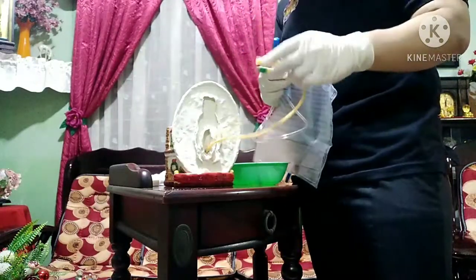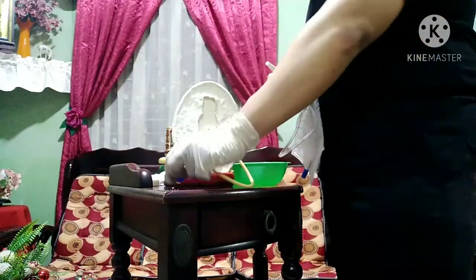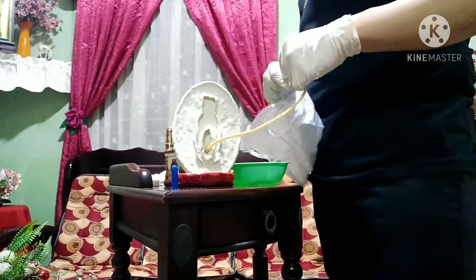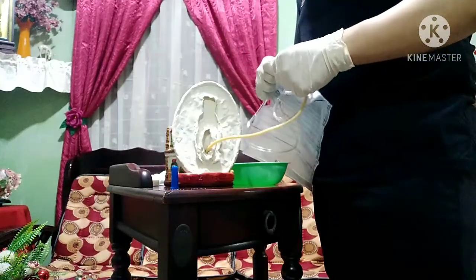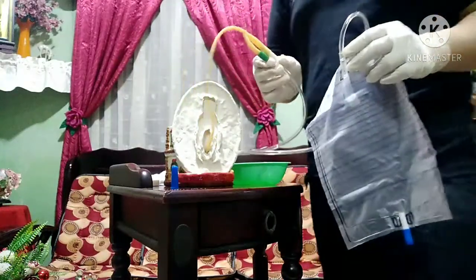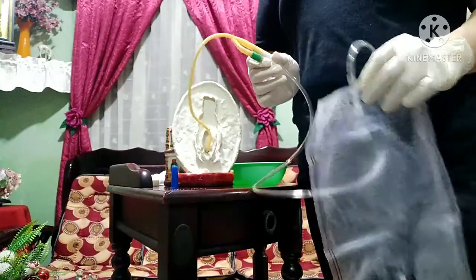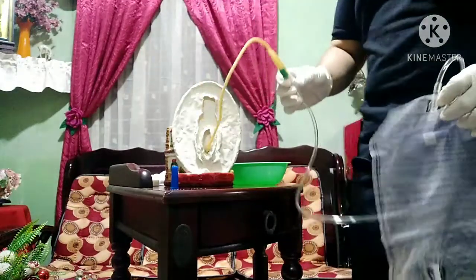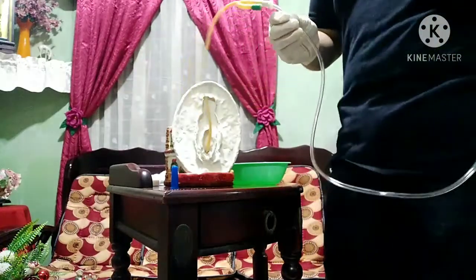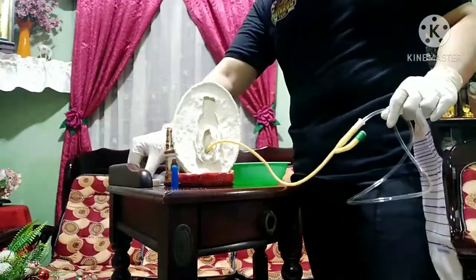So, ito po. Tanggalin natin yung cap. Then, connect na po natin. So, ito na po siya ngayon. So, ayan po. Step 22, secures the catheter with tape on the upper thigh po. So, i-secure na po natin itong catheter po around the patient's thigh po. So, gamit po tayo ng micropore tape po.